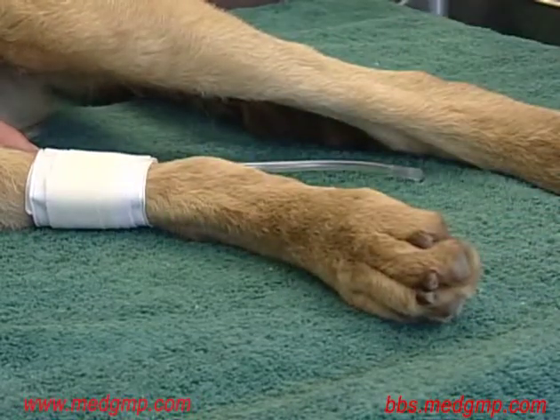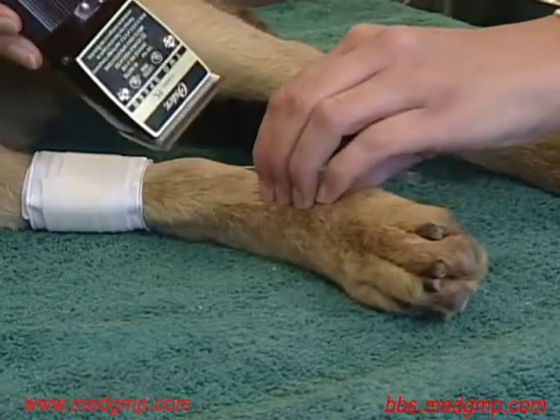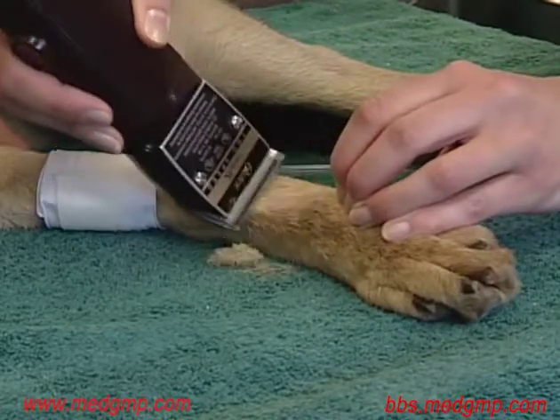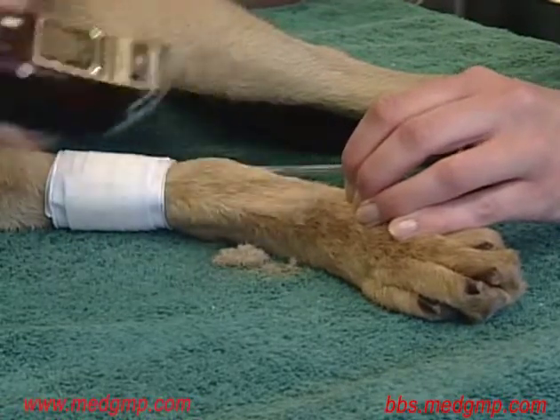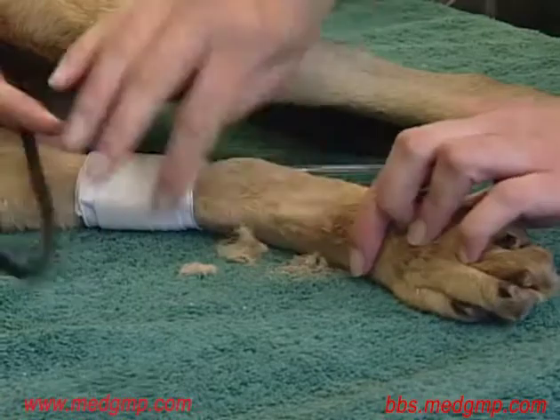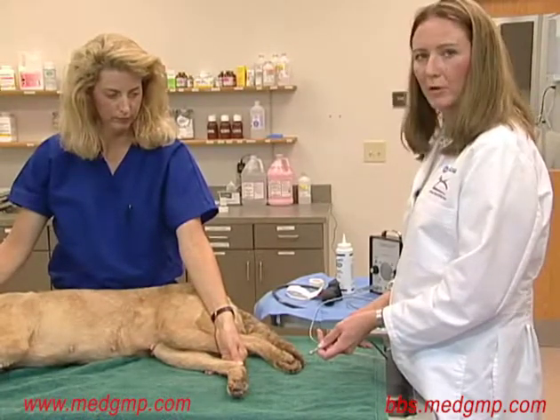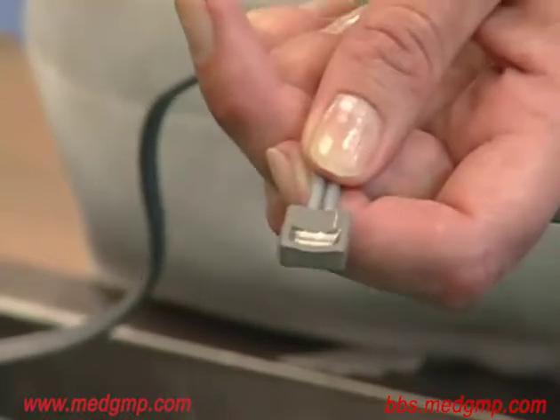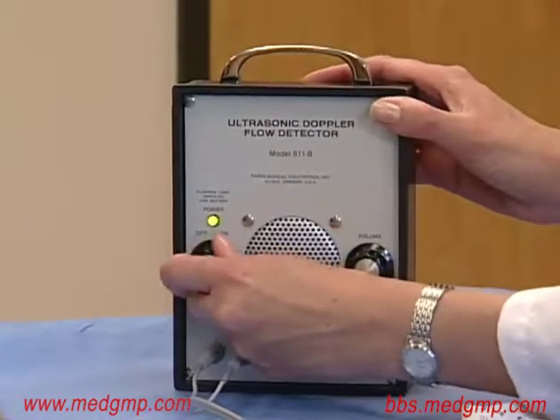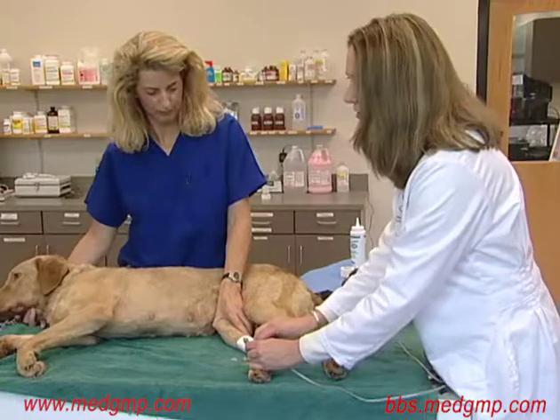Once we've located the pulse, we're going to go ahead and shave a small area of fur above that location. Once we've located a good pulse, we can go ahead and apply the probe. We need to apply coupling gel to the concave surface of the probe. I'm going to turn the machine on so we can hear the artery pulsating. Sometimes the noise can be distracting to some animals, and you can use headphones to try and minimize the distraction.